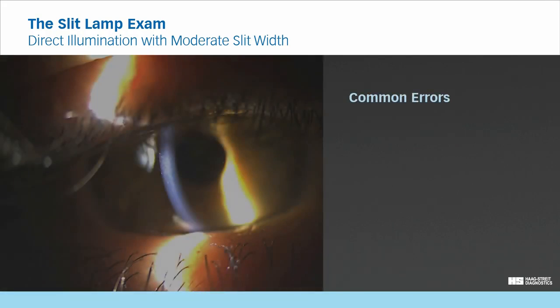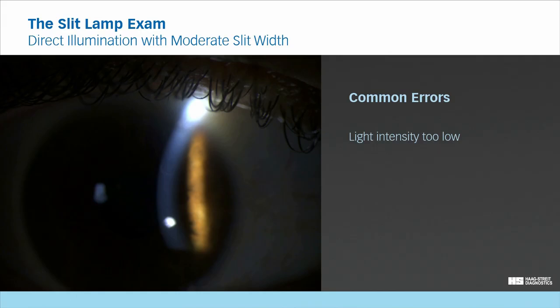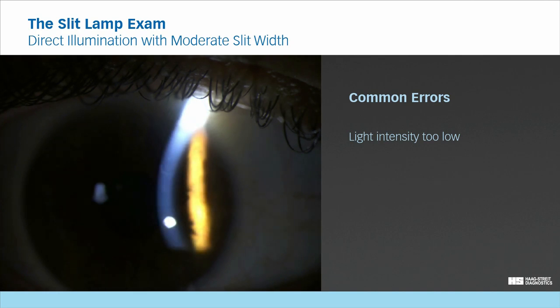Common errors. When examining the cornea with a light intensity which is too high, the patient will not cooperate well. If the intensity is too low, you might miss subtle changes on the cornea due to reduced light scatter. Here is the same image but with increased brightness, which makes this basement membrane dystrophy much more easily visible.